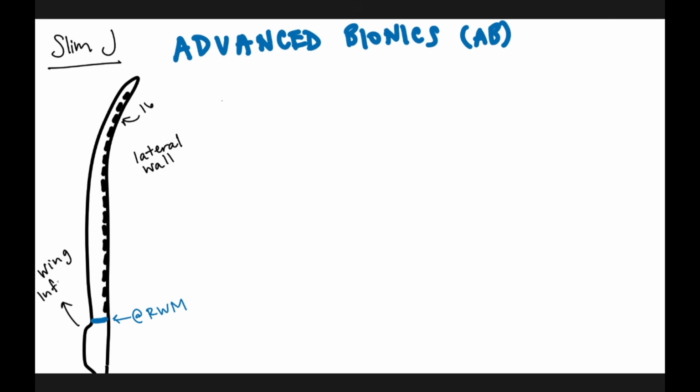The wing should be oriented inferiorly during insertion. You can remember this by how you draw little gull wings pointing downward. The second electrode is their mid-scala model.